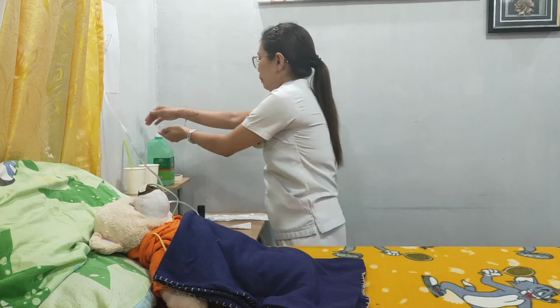Perform hand hygiene. Next is to report and record the procedure.